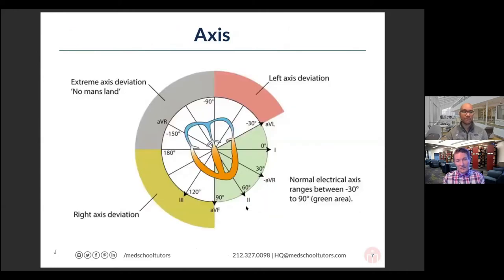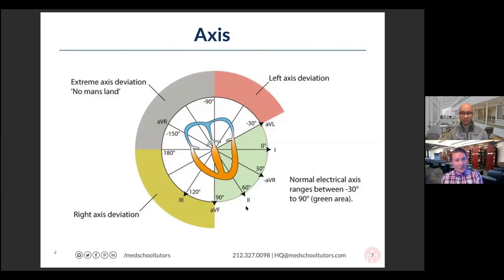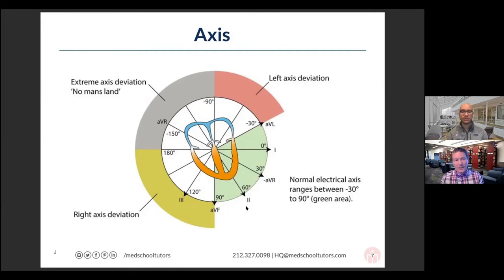A common question on clinical wards: what is sinus rhythm? It means P wave before every QRS and QRS after every P wave. You need to say both, because you could have a P wave without a QRS, or a QRS with no P wave before it. You need a one-to-one pairing between them to confidently state that the SA node is totally in control of the ventricles. If that ever doesn't happen, we're in arrhythmia territory.